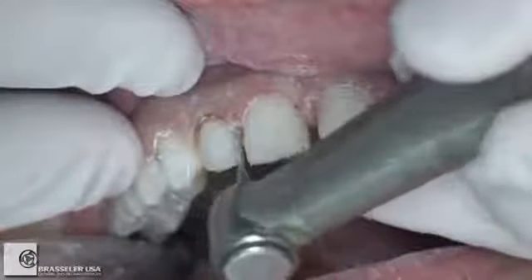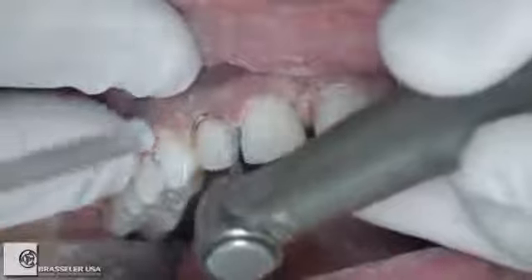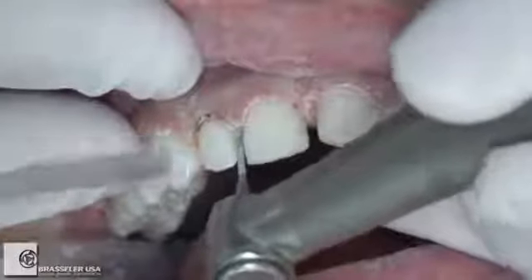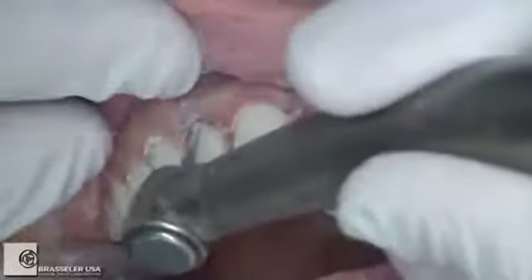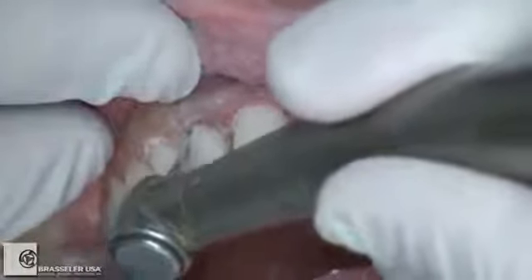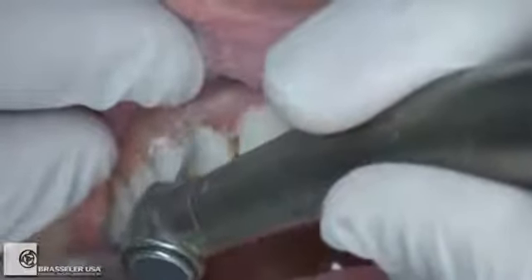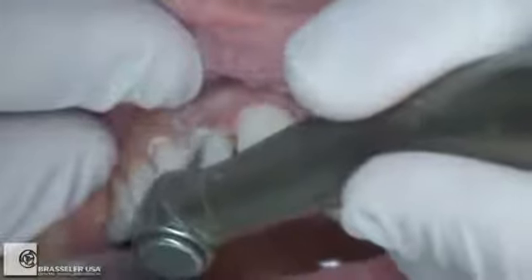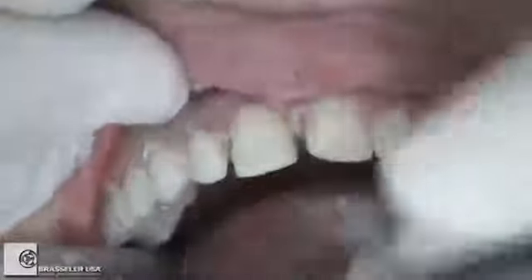We'll go into the lateral incisor now, and since there's a little bit of an undercut there and we're going to widen the lateral, the finish line needs to go toward the lingual transitional line angle. So I'm doing what's classically called a slice preparation right there. And now we'll put just a light finish line on the lateral incisor, and you can see that I've already done that little bit of tissue sculpting that I previously marked with the diode laser.